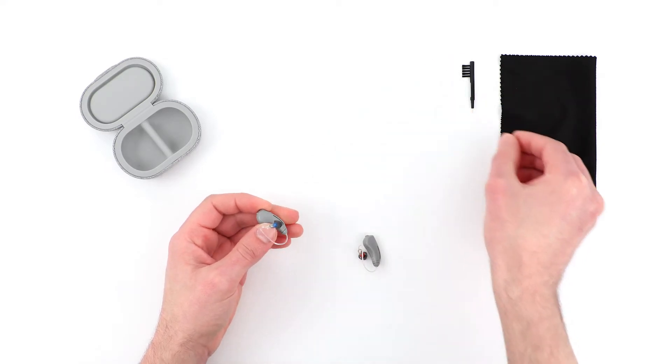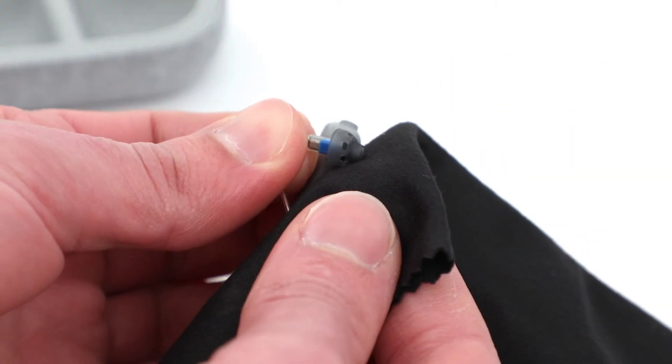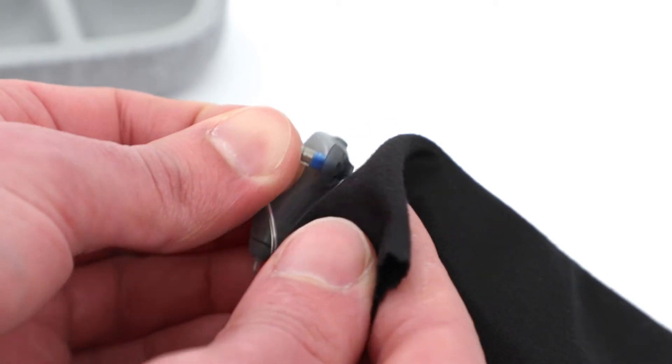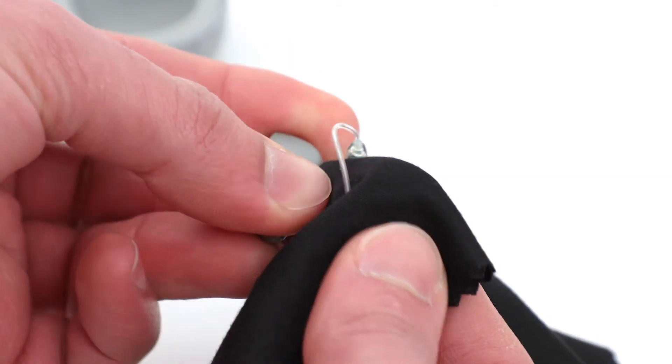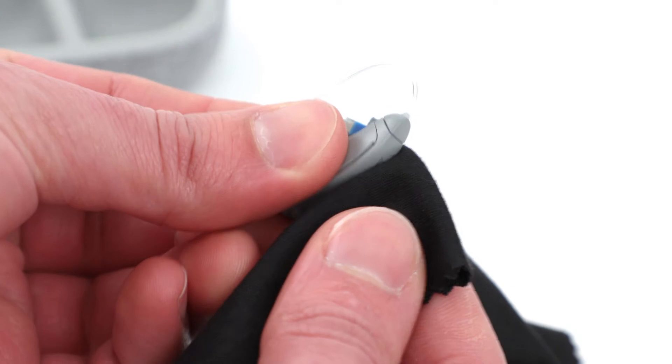Using a clean, lint-free cloth, remove any earwax and debris from the ear tips. We also recommend wiping the hearing aid cables and removing any moisture from the hearing aid body.